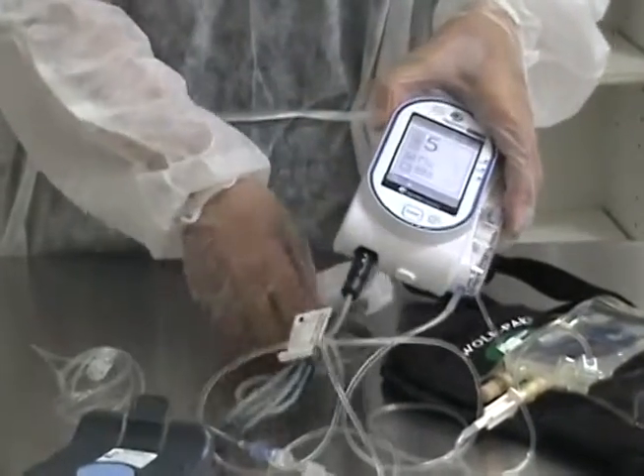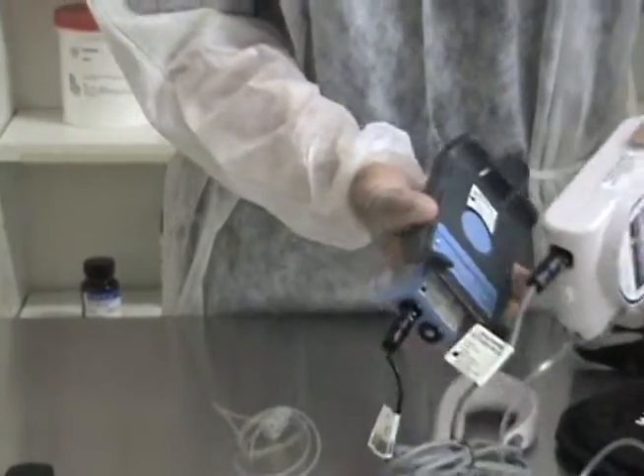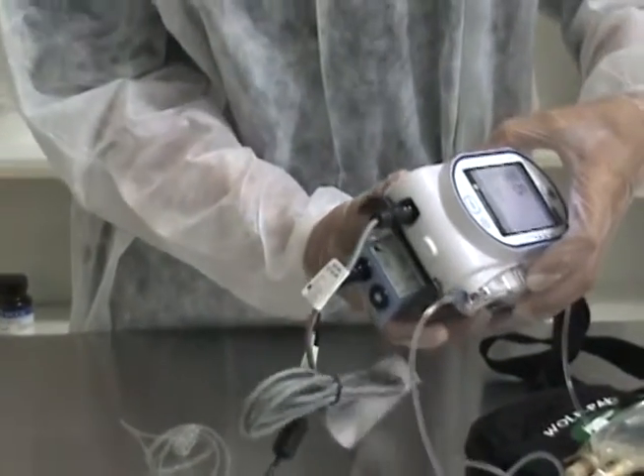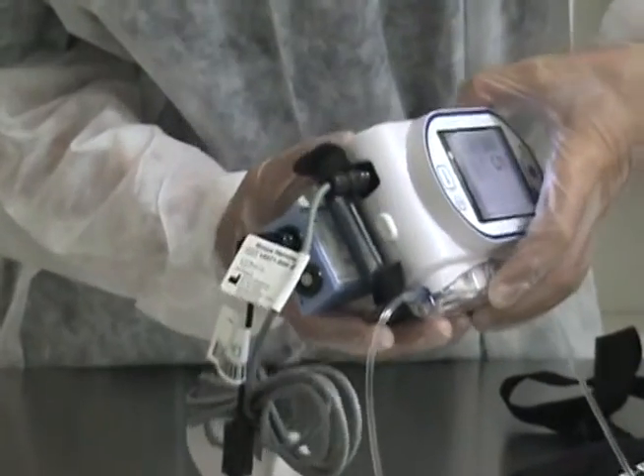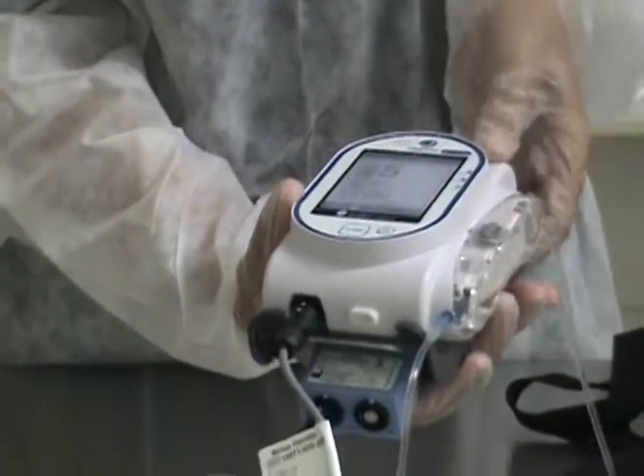To charge the battery, you can do so while the pump is infusing, and we've supplied the charging dock to do so. All you do is slip the pump into the dock and clip it into place.